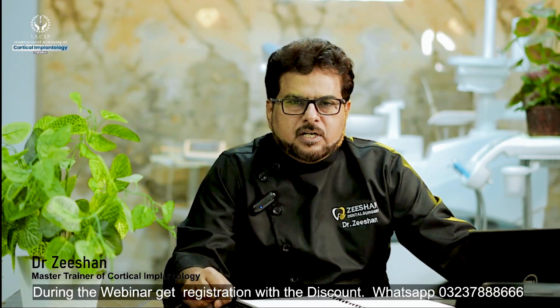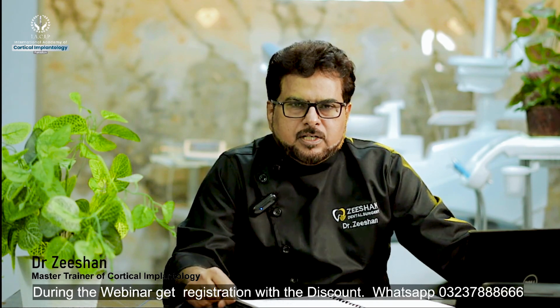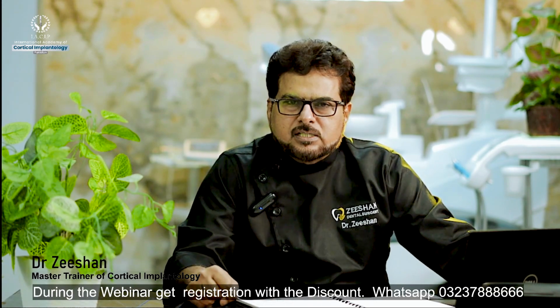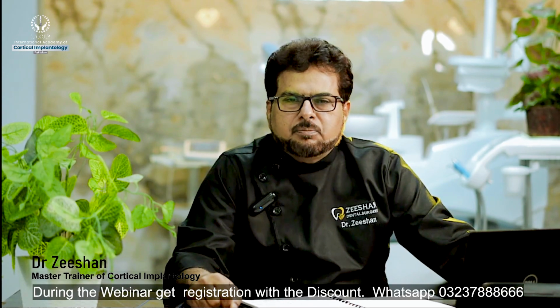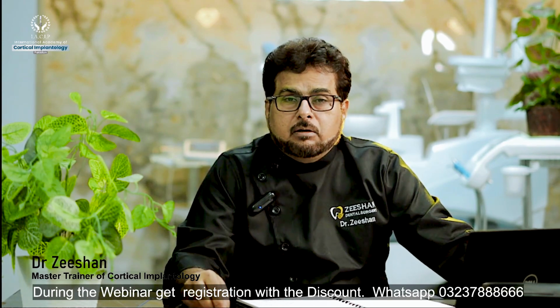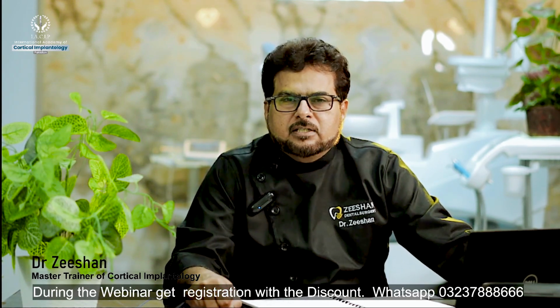But to reach the basal bone during our surgery while placing the implant, we have to be very courageous, and we should have good knowledge and skills to reach the basal bone and engage our implant in the basal bone. So they call it bicortical, engaging two cortexes to increase our primary stability so that we can load them immediately. This is the protocol.